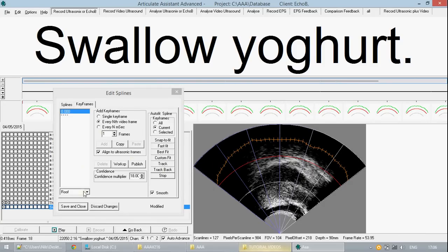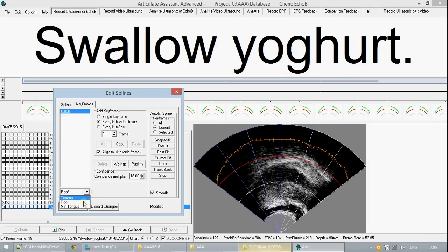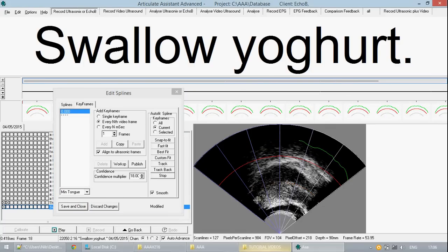The roof contour will define the upper boundary for when we are in future using the automatic tracking fitting for the tongue boundary. MinTongue is similar at the lower boundary.